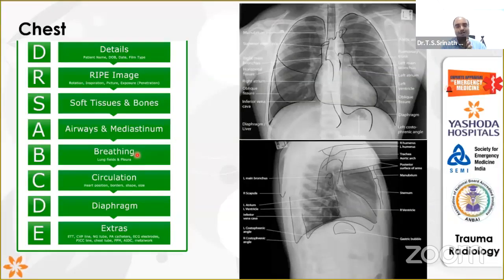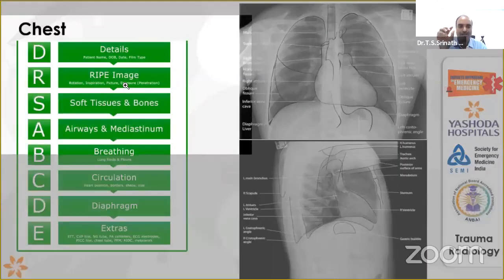We'll order a chest X-ray, we'll say it is normal. That is not the way. Go from lateral to the medial, or go from the medial to the lateral. When you document it for the first few patients, then it will become your routine to document it. If you don't document it, you are going to lose the patient.